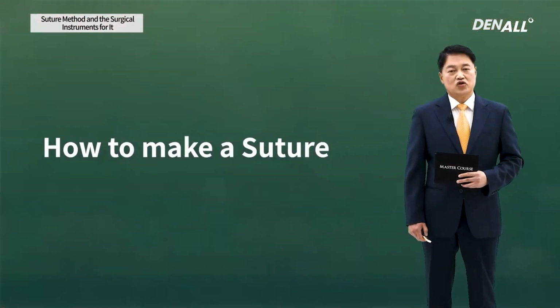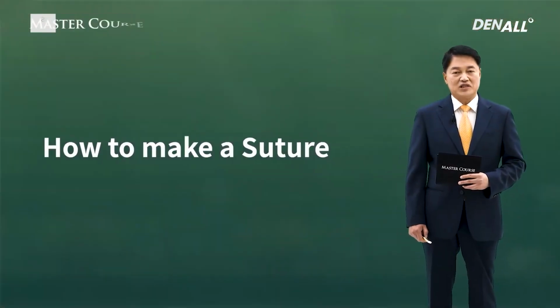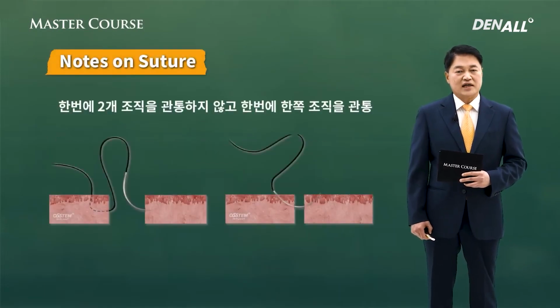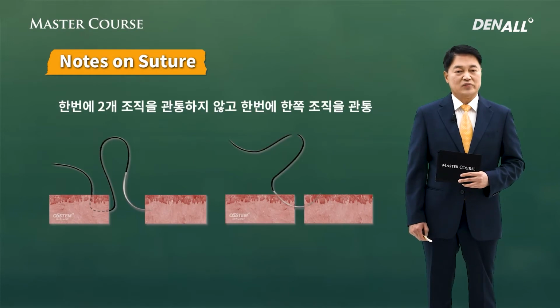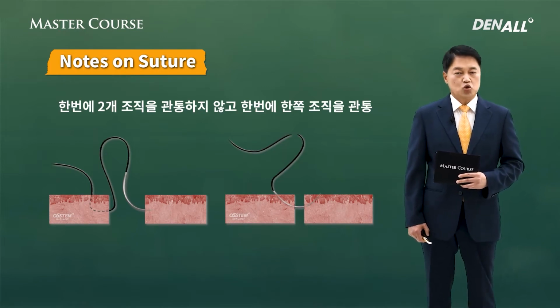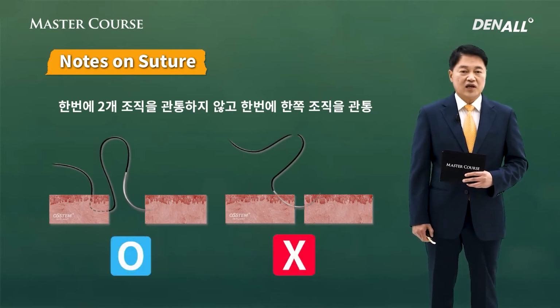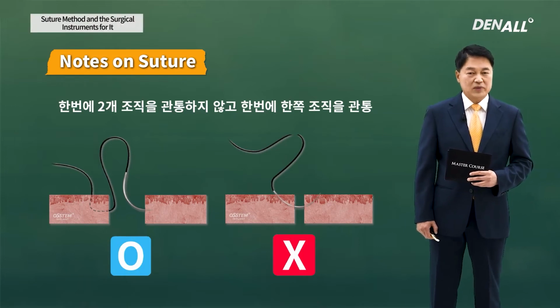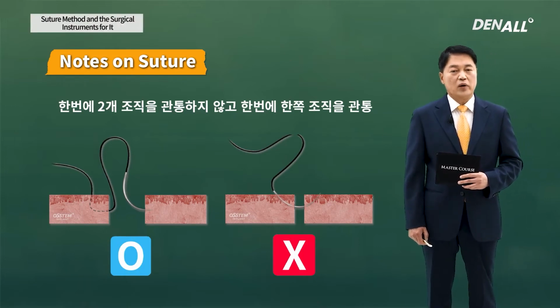Now let's look at how you actually do a suture. In suturing, the most important thing will be, as you see, at once, you don't cut through two tissues. You only cut through one tissue, go out again, and then go to another tissue. That would be a better way. This is because if you have a V shape, it's not good. You need to have a U shape.